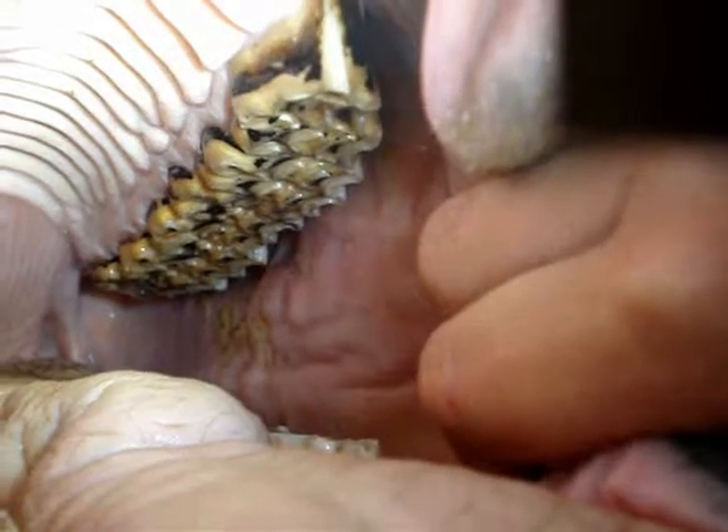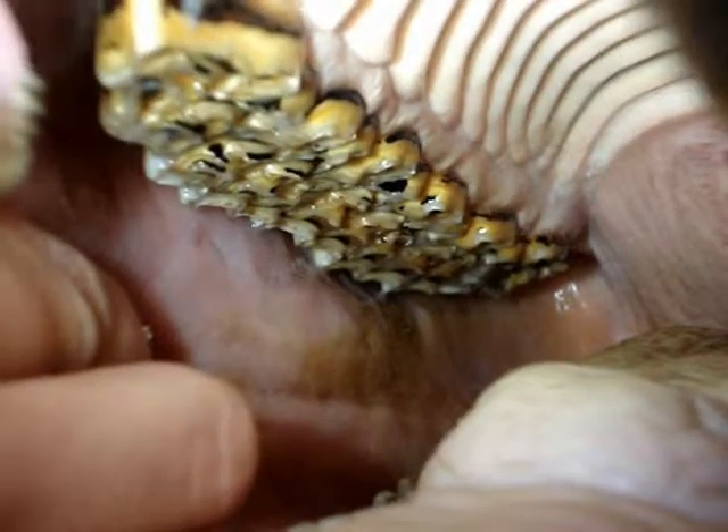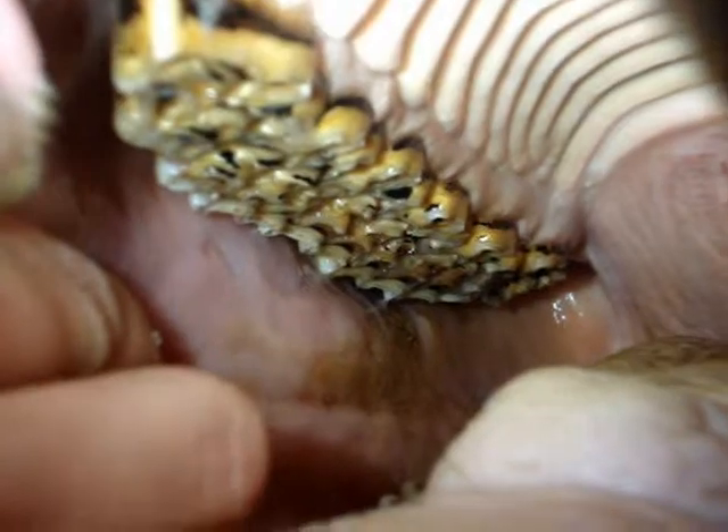A complete exam of the mouth is done visually first. We are looking for any sharp enamel points that may be causing ulcerations on the tongue and cheeks. This horse demonstrates cheek lesions being caused by sharp enamel points on the upper arcades.